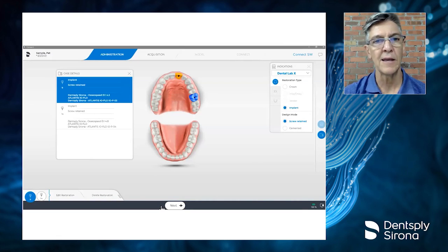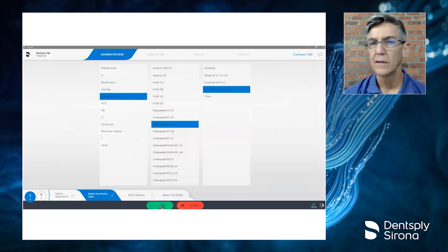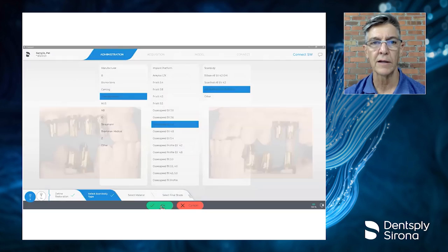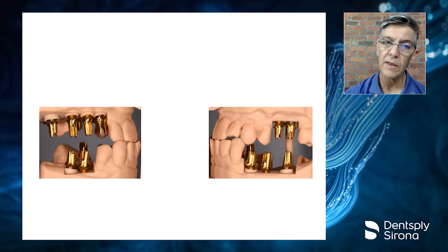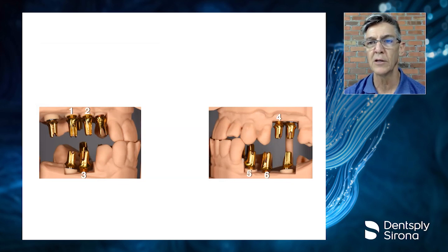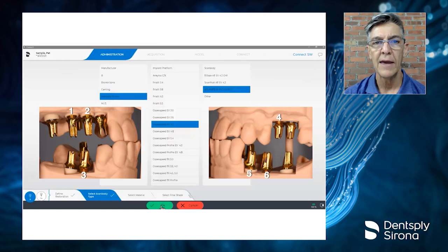Now we might look at this and say, well, that's kind of an excessive amount of work. I've got to go back and do this. Well, you would have had to have chosen two different scan bodies anyway. But why this is a benefit is that there are times where we have multiple implants of the same dimension. So when we're going to order our abutments or make our scan, if we have multiple implants of the same dimension, we can go back, enter it.